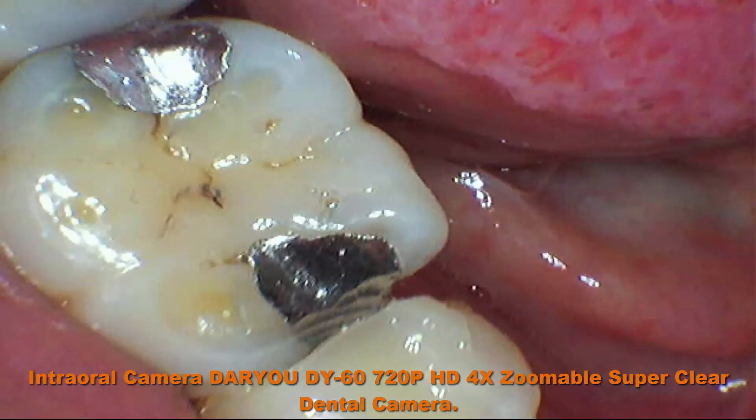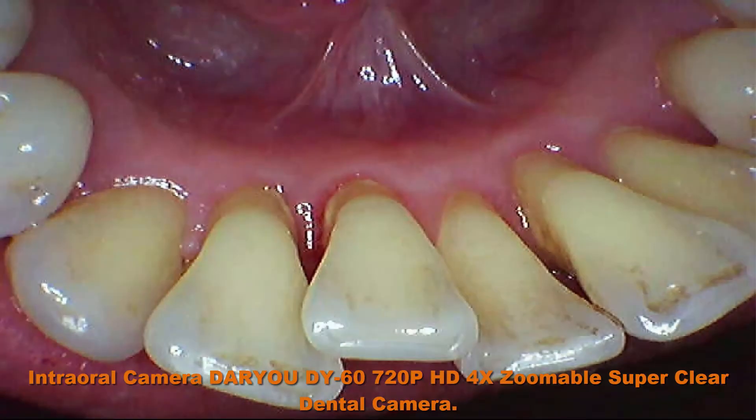Don't buy if your imaging software is not in the above list, unless you agree to use this camera's own software. No foot pedal required.